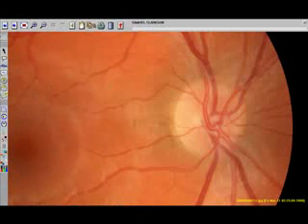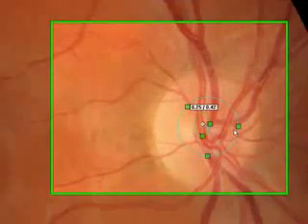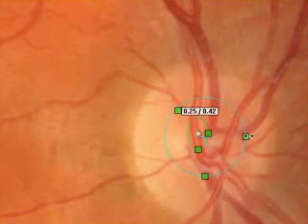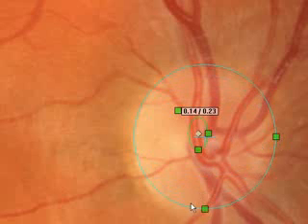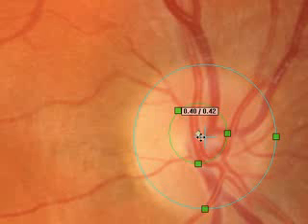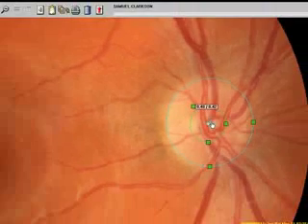To measure a cup-disk ratio, press on the cup-ratio tool. Click on the center of the disc. Move the boxes out to be coincident with the outside of the disc, and then move the cup squares out to be coincident with the cup. You can move the triangle and the cross inside to adjust the circle itself.